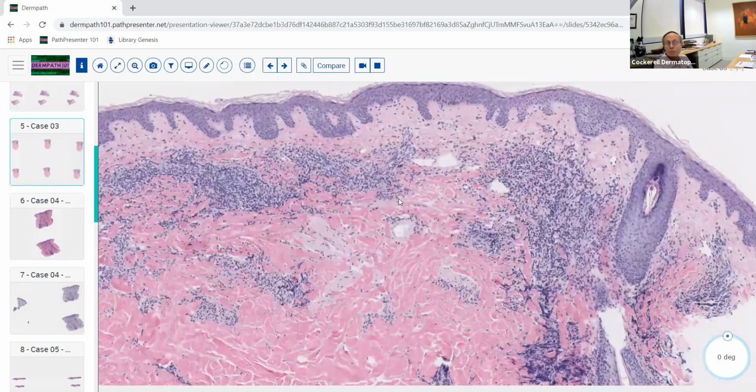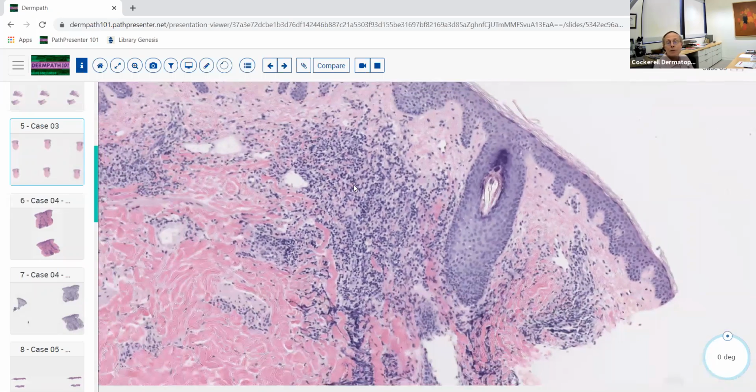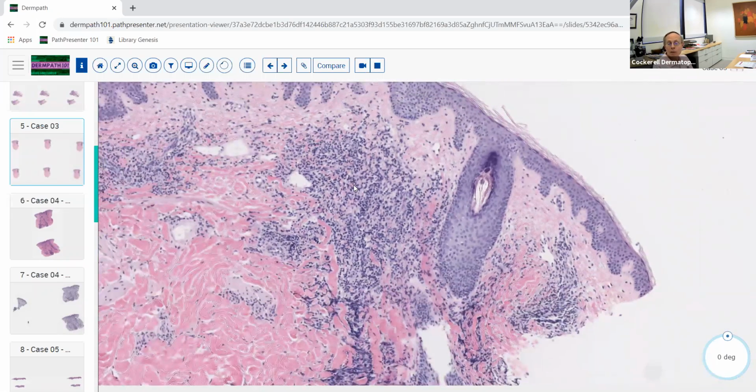So Borrelia is a spirochete. It's a bacterial infection, and you may actually be able to identify the organisms. If you do an immunoperoxidase stain directed to the actual Borrelia organism, it will highlight that. Sometimes if you do an immunoperoxidase stain for T. pallidum, it will cross-react with the Borrelia. Not strongly, but you can sometimes see some reaction. You may pick up a few organisms.